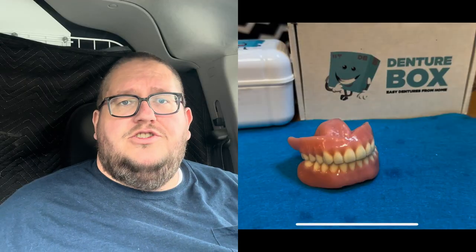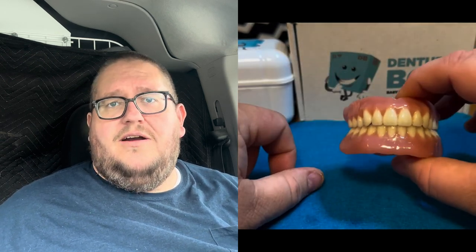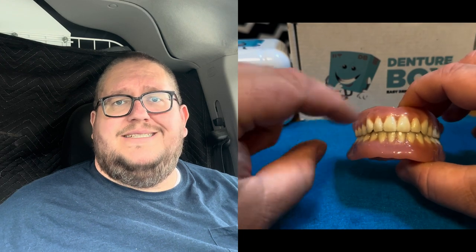First thing I'll do is throw up a picture or maybe a video showing you what my 3D-printed dentures look like. If you're unaware of Denture Box, it's an at-home denture company — basically, you do not have to go to a dental office. Everything is done from home. Once you purchase a Denture Box, they send you all of the mold trays and putties to make molds, you send them back, and you get try-ins.